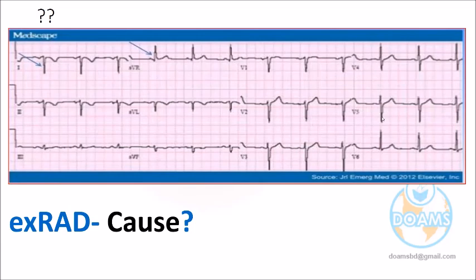This chest lead represents the precordial leads, this lead represents the limb leads. Has anything happened that the right limb lead is becoming left and left becoming right? What do you think? It could happen, but the chest lead is not changed. V1 is placed correctly. Who made the ECG? Who used the ECG machine? It can happen.